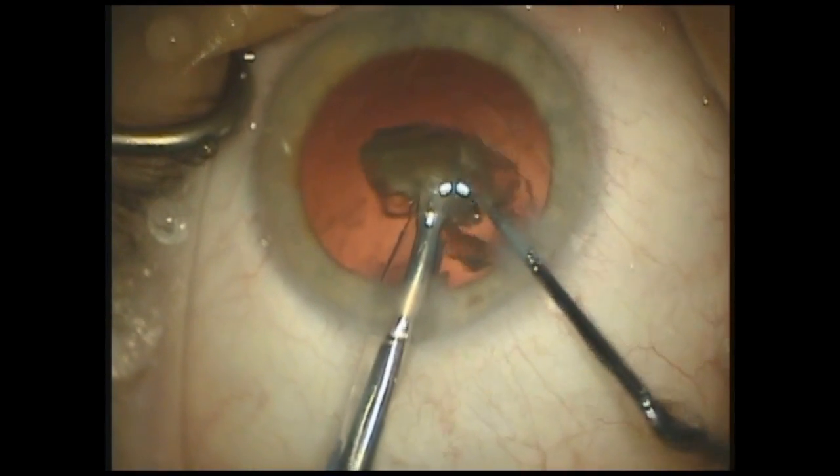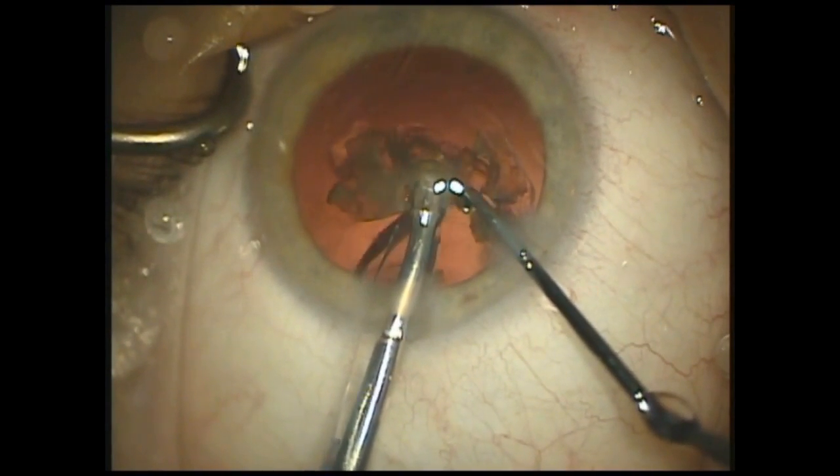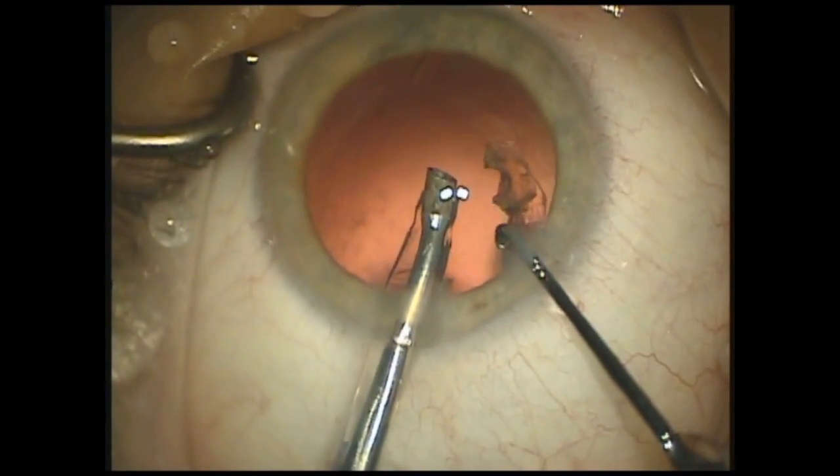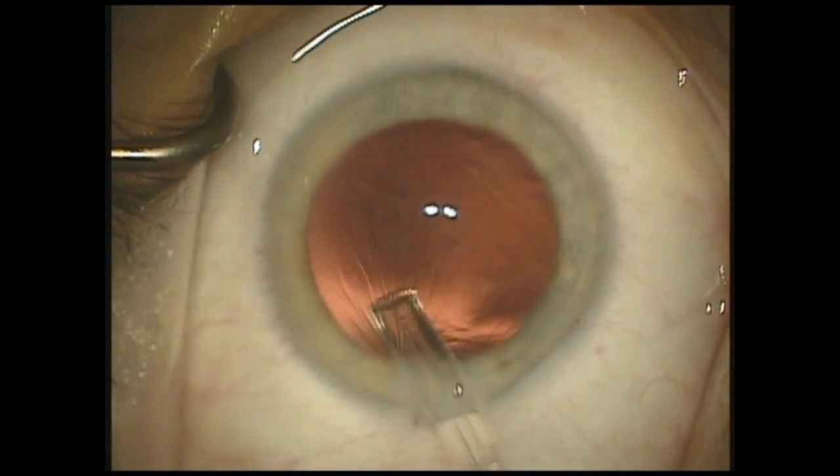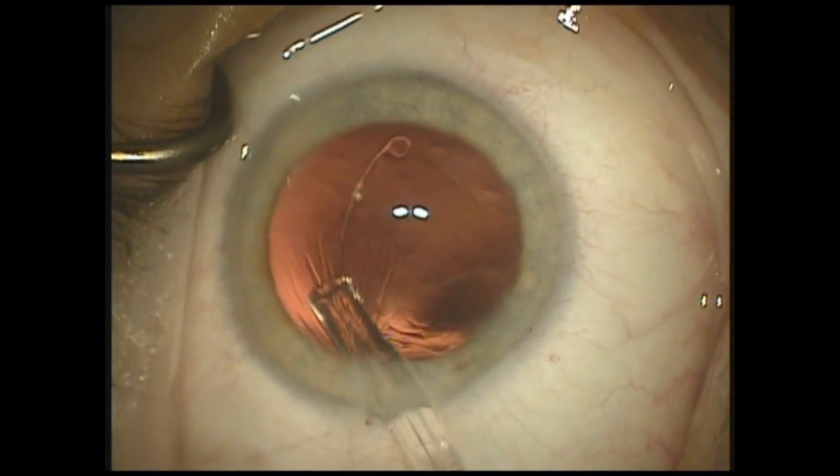Thanks to this dual linear system, the vacuum is low at the bottom of foot position 2, so that the last pieces can be safely emulsified. A CTR is then placed for the dialysis, and the eye is now ready for an intraocular lens.